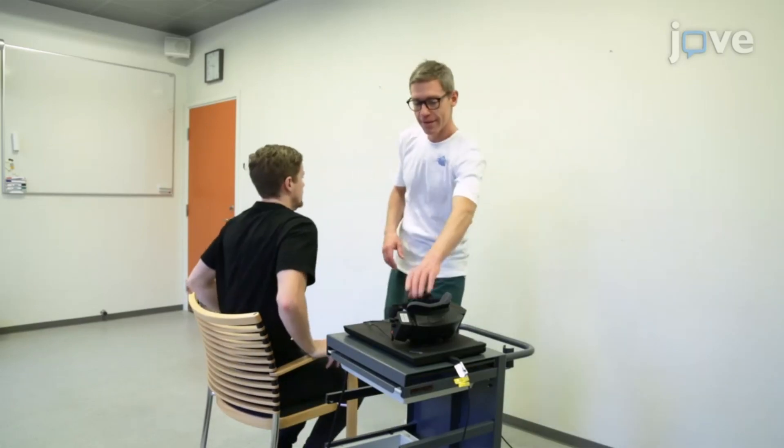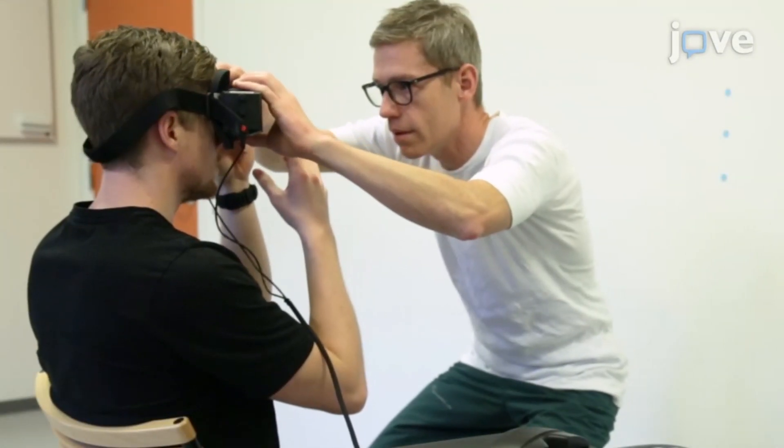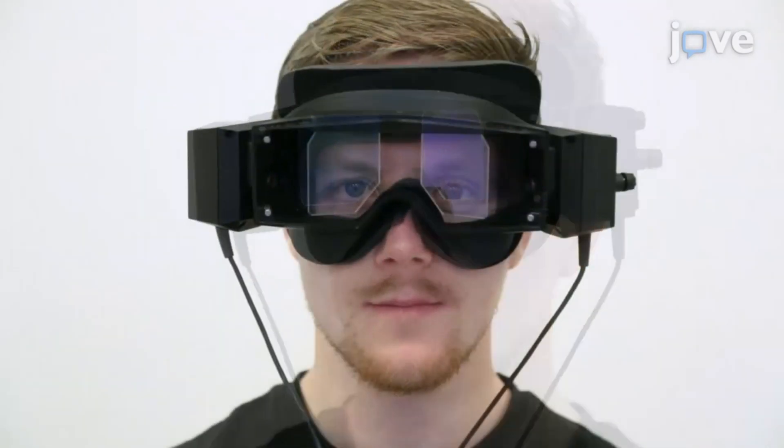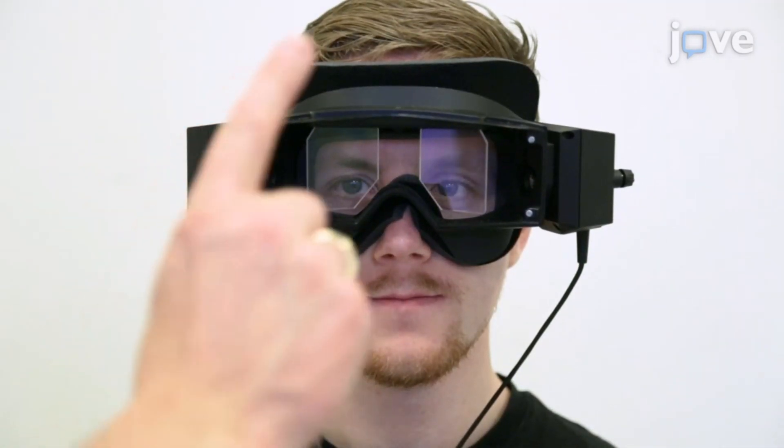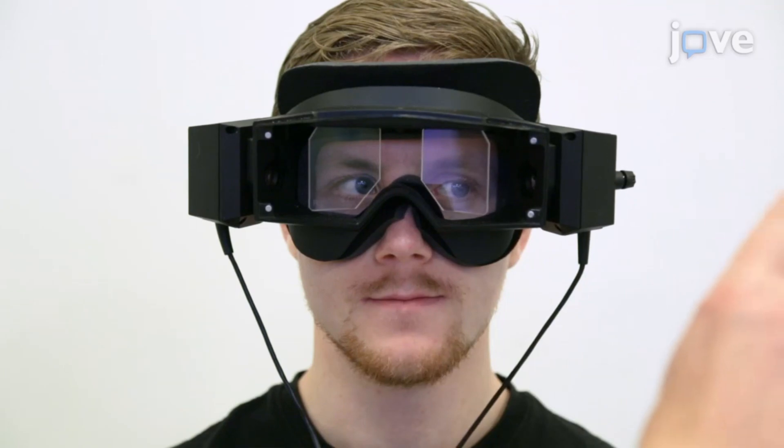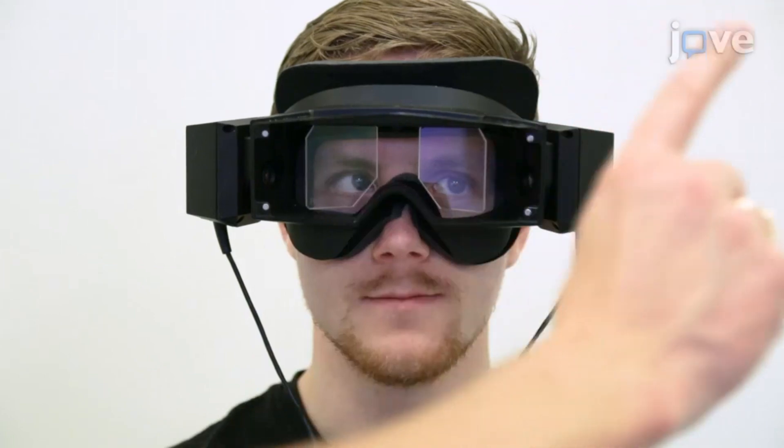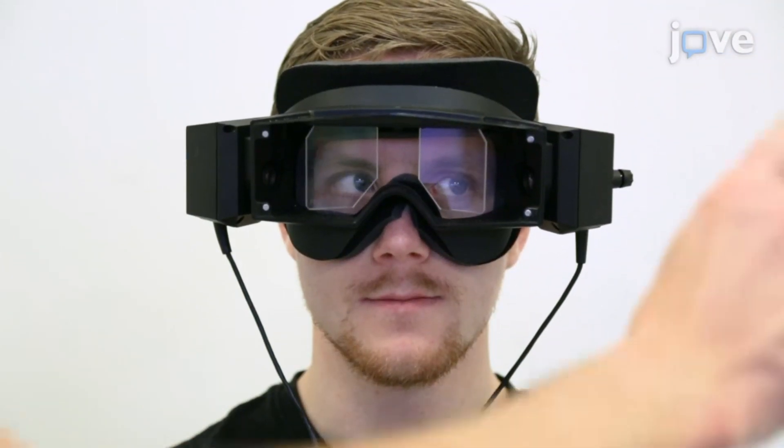Begin by escorting the participant to a well-lit screening room and mount video frenzel goggles. Perform a gross eye movement exam by asking the participant to move their eyes in the vertical and horizontal planes to the outer edge of the eye sockets to ensure no eye muscle palsies are present.